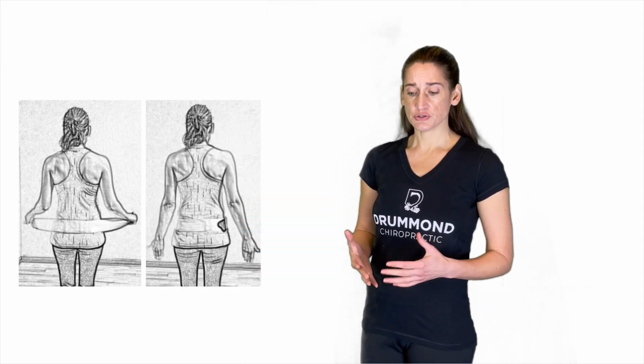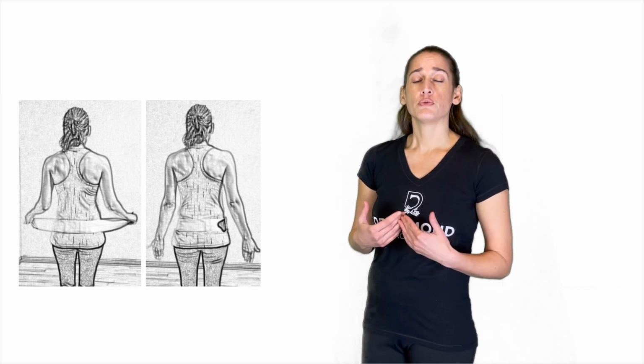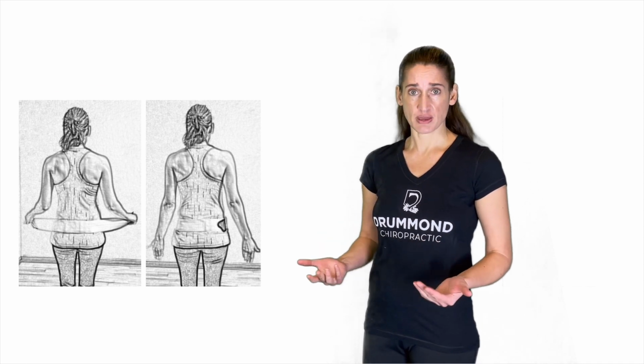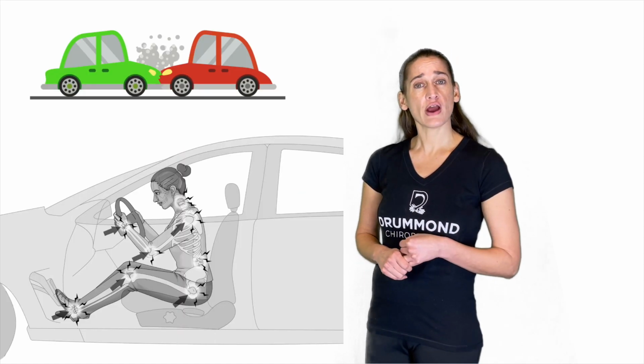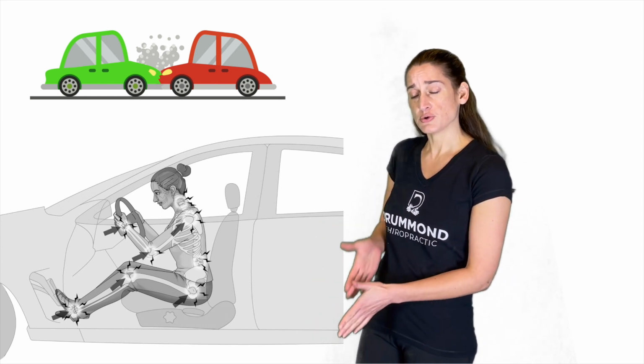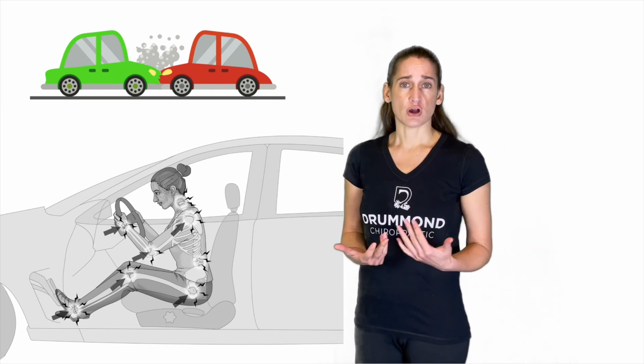The SI belt is used again for people who have a sprained SI joint. And how does that happen? The most common times I see people needing an SI belt is after delivering a baby, because that involves a really big opening of the pelvis, and that can sprain the SI joint. Another time is after a car accident. If you're hitting the brake really hard during impact, that force can transfer through the leg and sprain the SI joint. Or some other trauma.